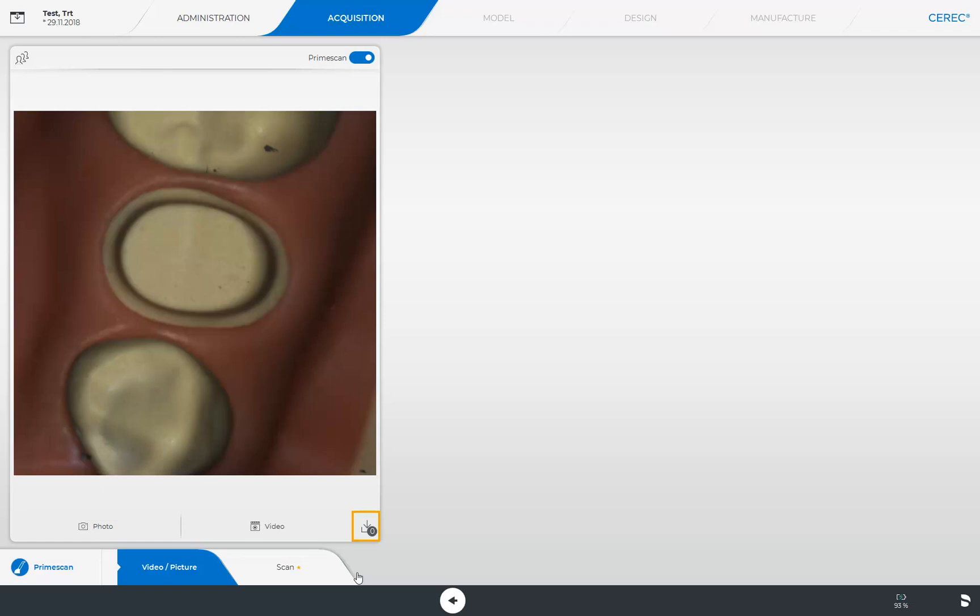Since we have not taken a picture or video, a small zero is displayed in this field. The media files are retrieved by tapping the button. At this point, we go back to the scan step, where all the scans for the three image catalogs were already performed.